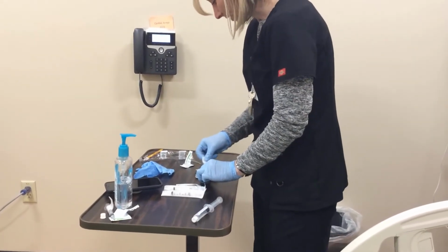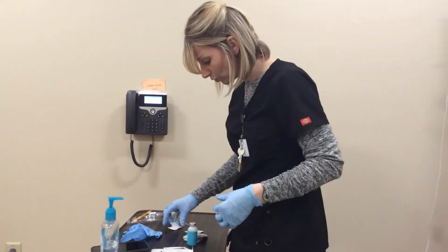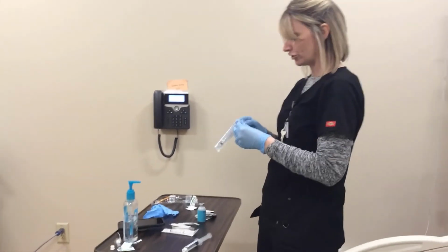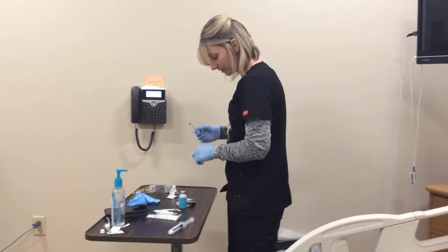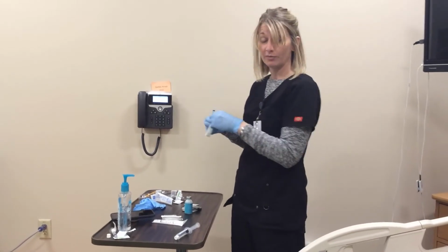Solu-Medrol, I'm verifying my order again. I verified the right patient. I've already double ID'd. I never left the room. I look at my order. I look at my allergies. It's not allergic. Look at my order, and my order is for 40 milligrams of Solu-Medrol to be given IV every 8 hours. It is the correct time for me to give.